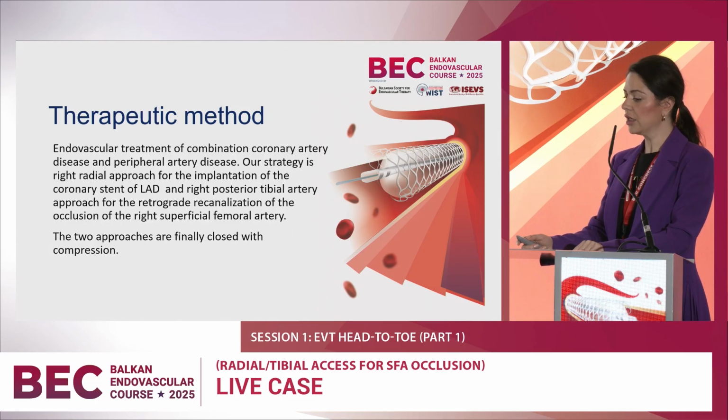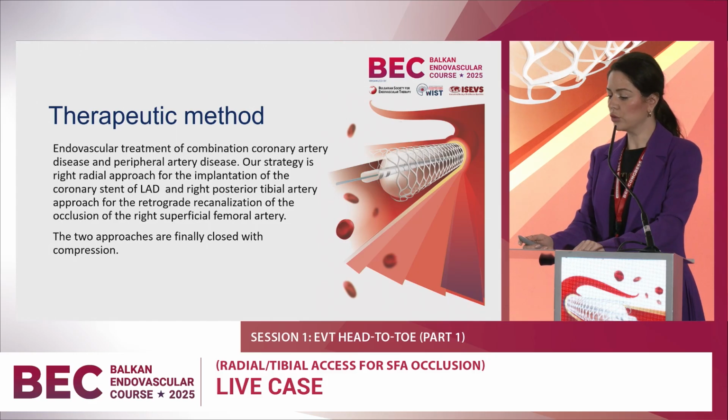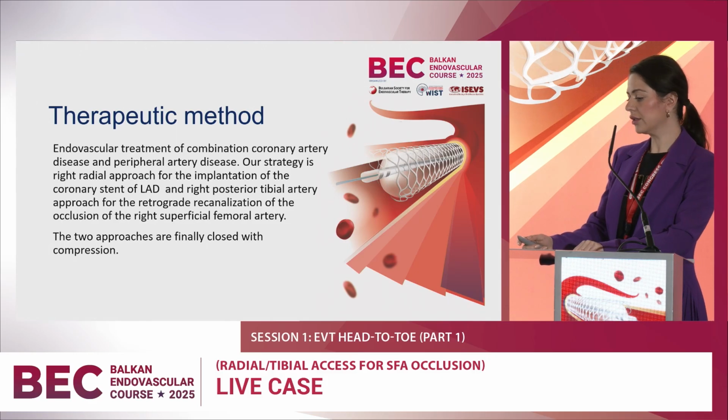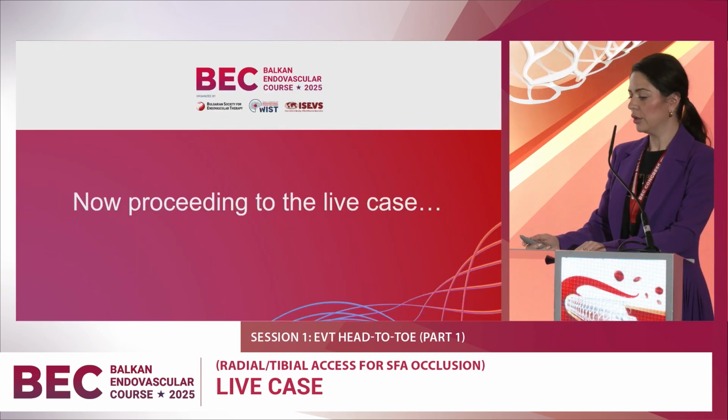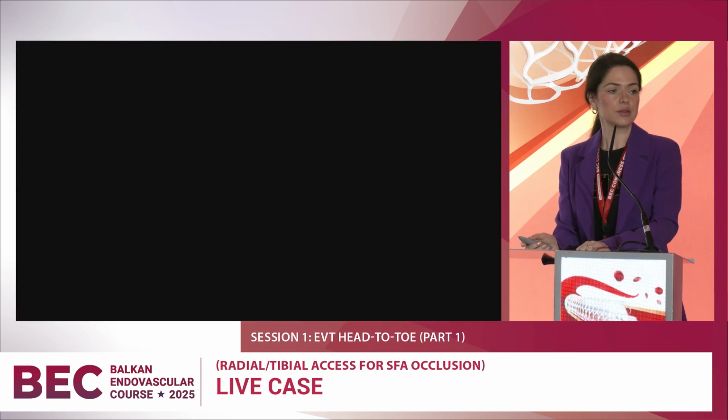Our strategy is a right radial approach for the implantation of the coronary stent in the LAD, and a right posterior tibial approach for the retrograde recanalization of the occlusion of the right superficial femoral artery. The two approaches are finally closed with compression. For now, proceeding to the live case.